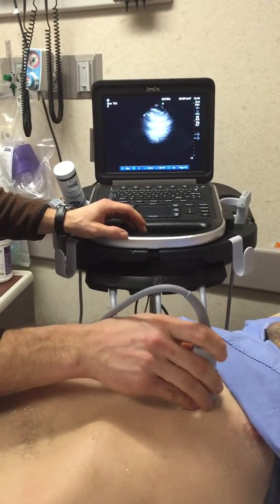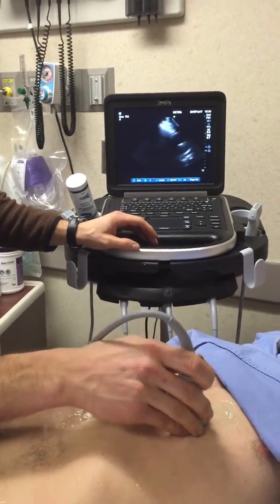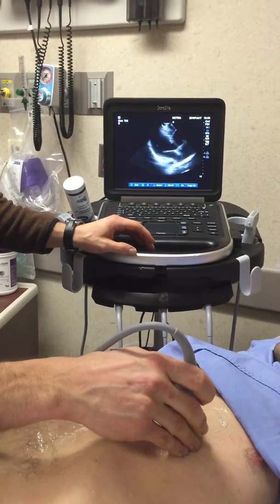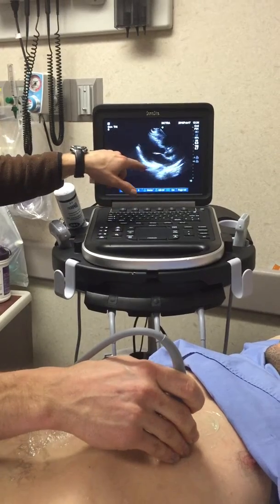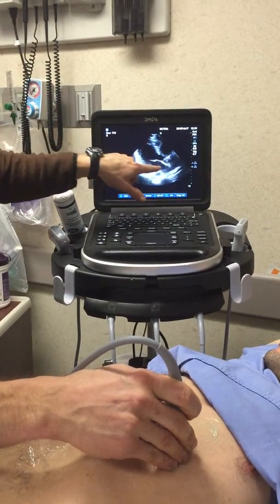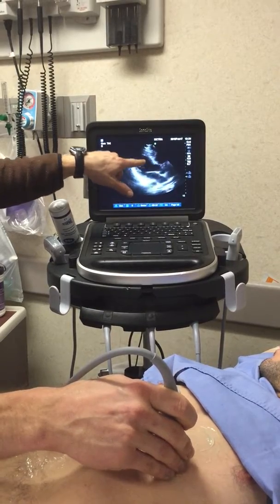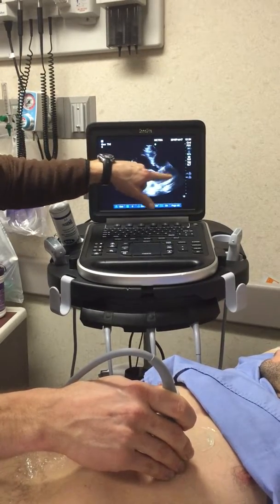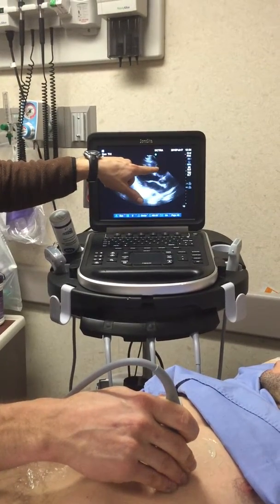So usually you start with kind of big sweeps until you start to see some cardiac motion, and then you localize in. There you go. So there's the parasternal long axis. There you can see the left ventricle here. There's the left atria, mitral valve, slapping with the septum, left ventricle, and then the outflow. So it kind of goes swoosh up here and then out. And on top is the right ventricle there.